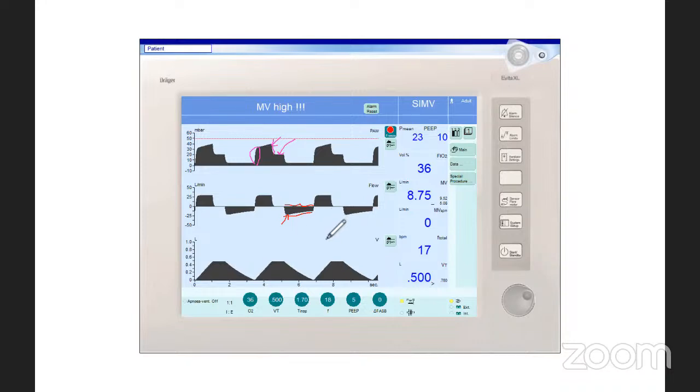So you can see here that there is persistent flow at end of expiration. This indicates that we have auto-PEEP and that's what you see here - the plateau pressure is increased because there's auto-PEEP in the system.